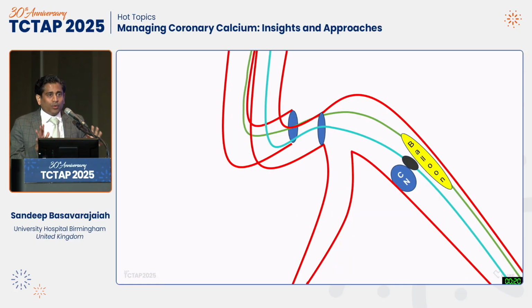I don't know, this is purely hypothetical, and we've been discussing it with Colombo. We should probably do some bench testing and maybe do a ping pong, take a balloon, and improve the wire bias more towards the calcified nodule; maybe we'll get more debulking. Certainly, I've not tried this in any patient, so don't worry, it's for the future.